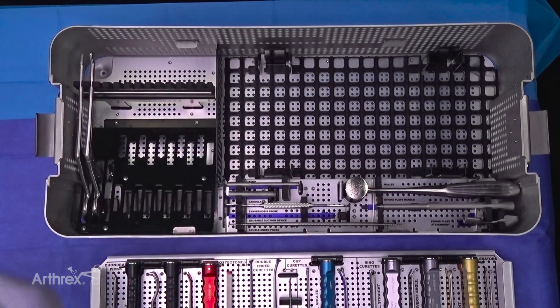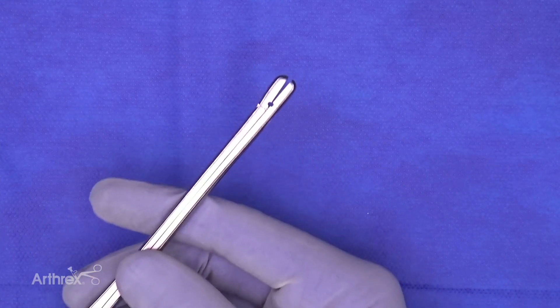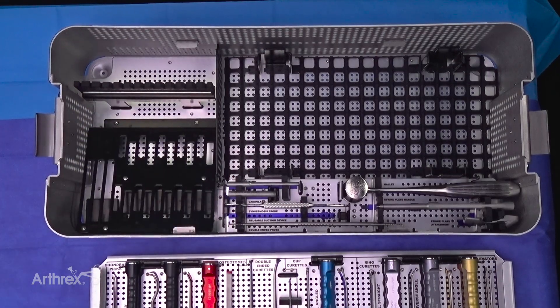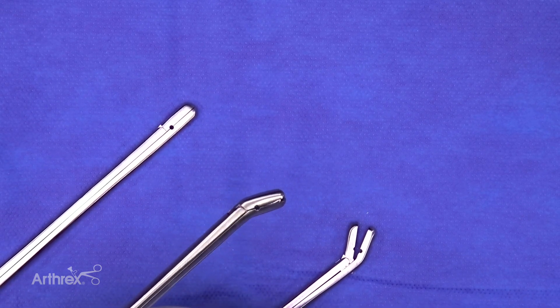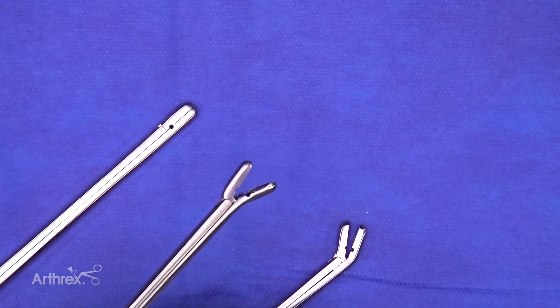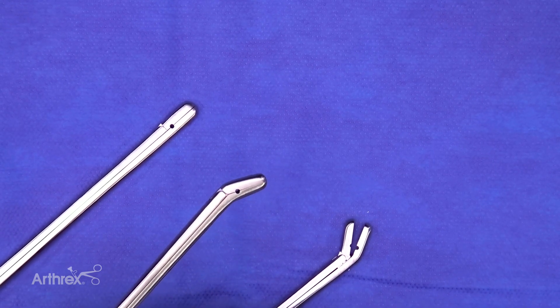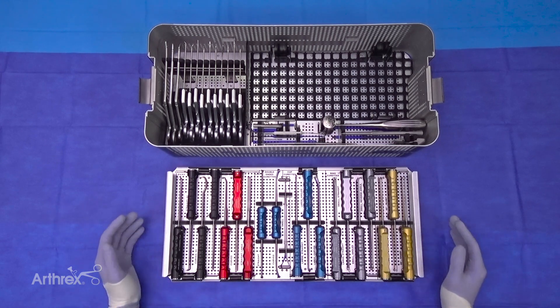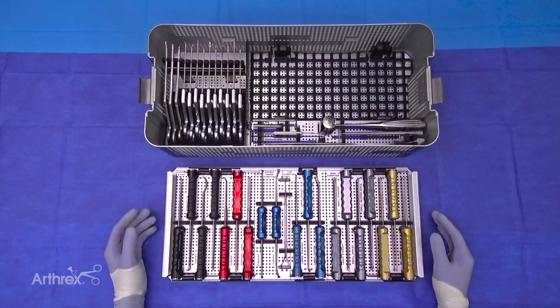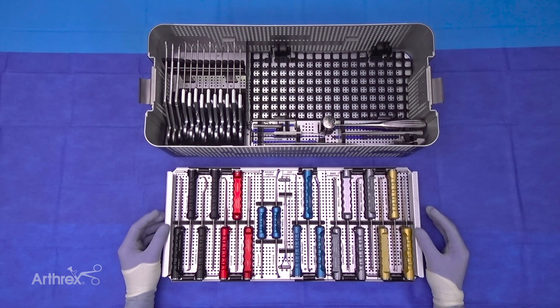Three instruments I think will be great for arthroscopists are the pituitary rongeurs — available in a straight biter, an up-curve biter, and a down-curve biter. These are excellent for removing osteophytes from the anterior talus or any situation where the surgeon needs to aggressively remove and hold onto bone while pulling it through the portals. This set has also proven appealing to sports surgeons who see applications in knee, elbow, and shoulder arthroscopy.